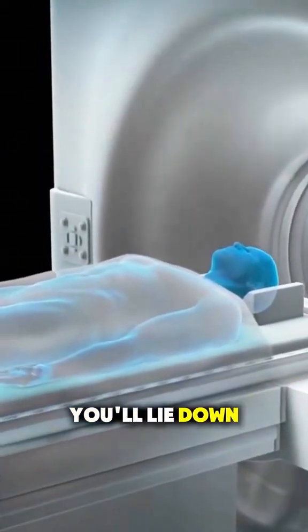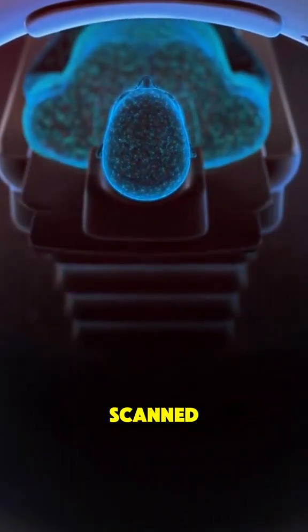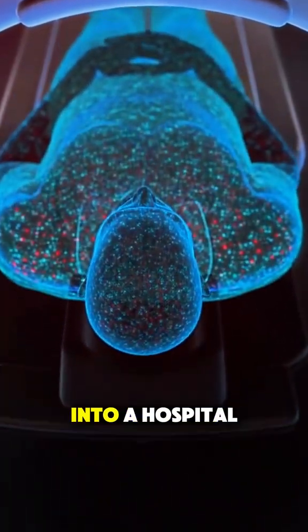First, you'll lie down on a narrow table, and depending on the area being scanned, you might be asked to change into a hospital gown.